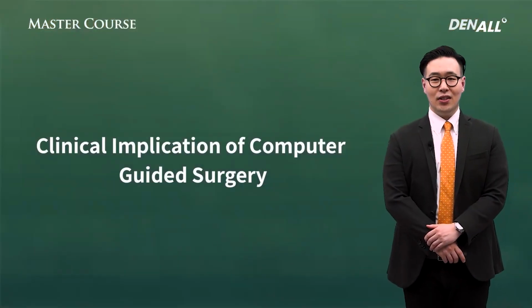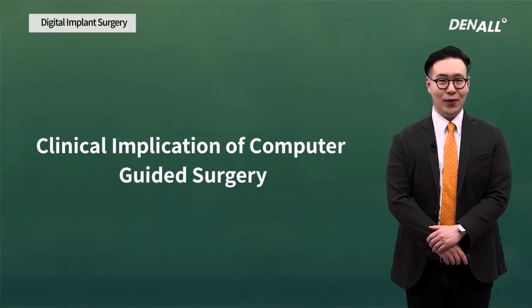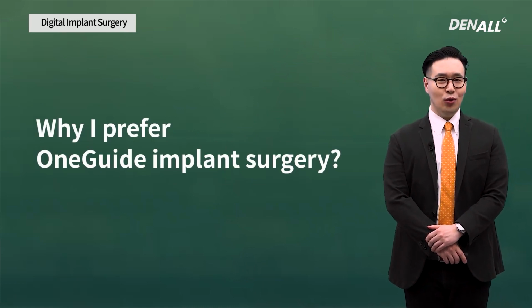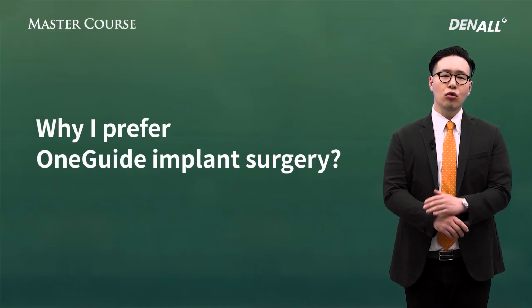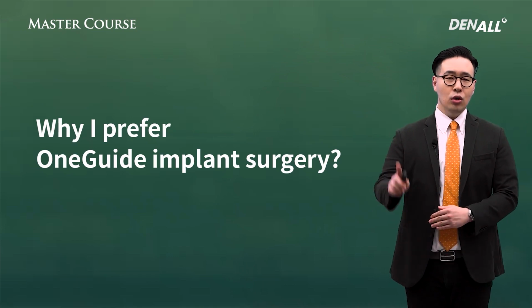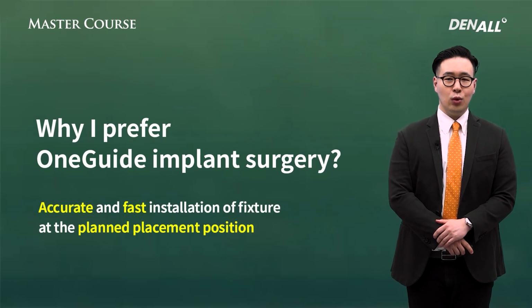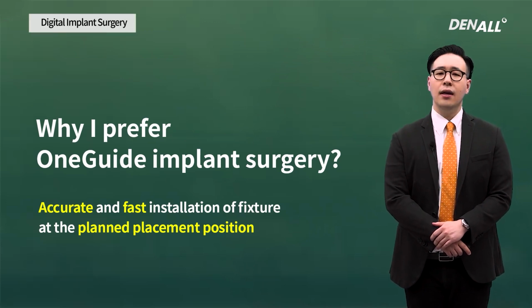Digital surgery using a guide template, is it really helpful clinically? Can we really trust it? I really believe so. Down the road, except for very few cases, the guided template will be more and more widely used. Then, why would I like the guided template using surgery? Because if the data is merged properly, implants can be placed at the ideal positions faster and more accurately.